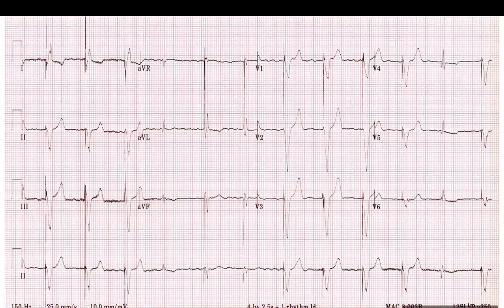Yes. Can we say from the pacing spike itself, because it looks smaller than the one in the previous, or the first three QRS complexes, and the latter QRS complexes? So the first one seems to be kind of a wide QRS that is consistent with a captured ventricle from the pacing. But right, when you go into the middle ones, it's narrower. So it's not totally paced. There is something else happening. So most likely there is a fusion between the paced and the intrinsic.